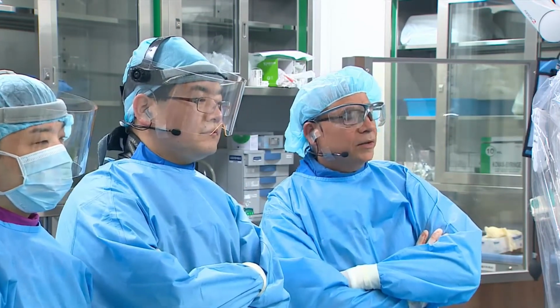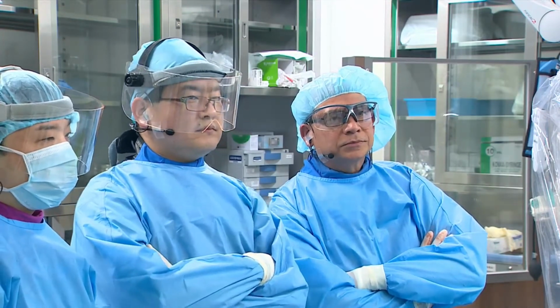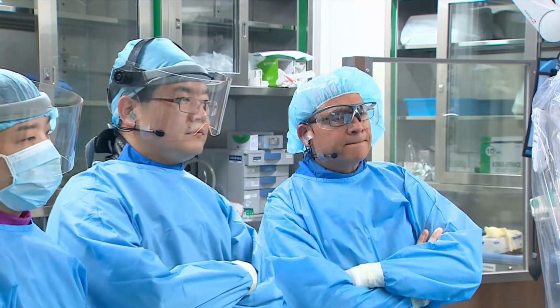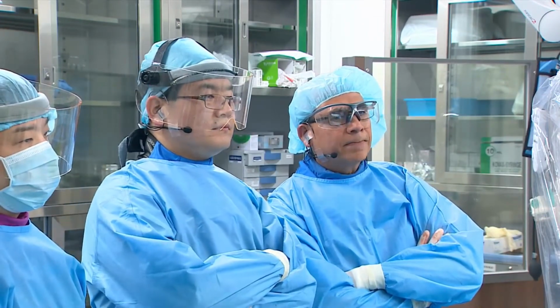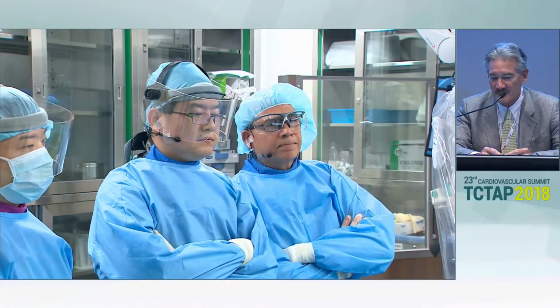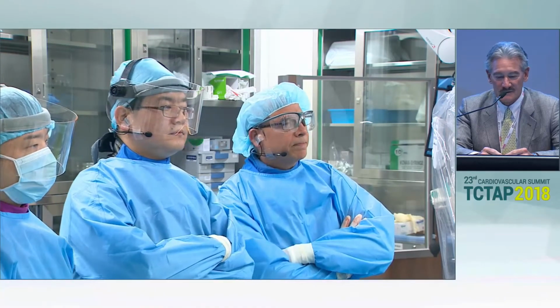I think that's a good strategy. That's the way I would approach it too. I would keep your control angiographic catheter across the common iliac lesion on the right up in the distal aorta. So if you do get any plaque shift as you work, you have it protected, and you can always stent the right common iliac as needed. And I would start retrograde as you have outlined.